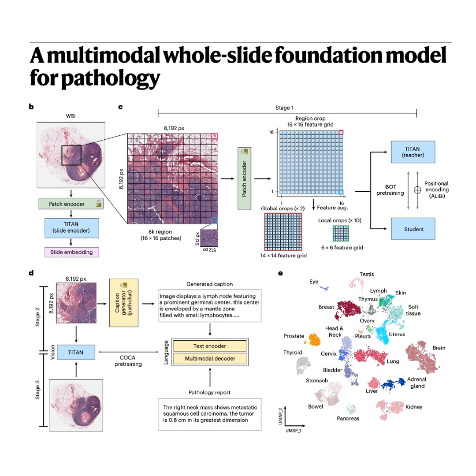We have to talk about data scarcity. Absolutely. Because when you're dealing with common cancers, you might have hundreds of thousands of slides to train on. But for rare cancers, the ones affecting fewer than 15 people per 100,000? Right. Your training set might be tiny.